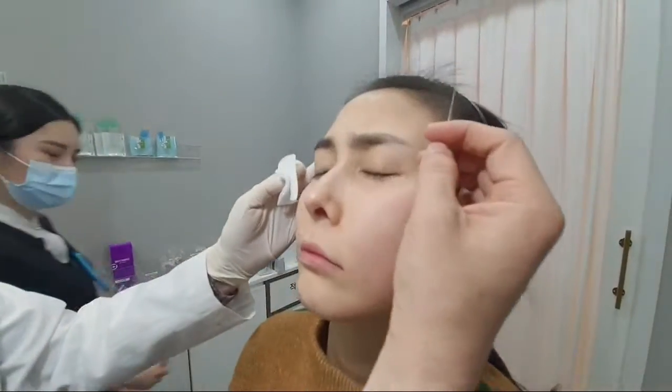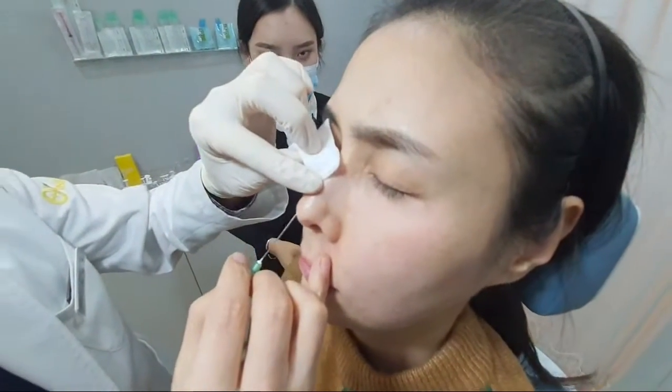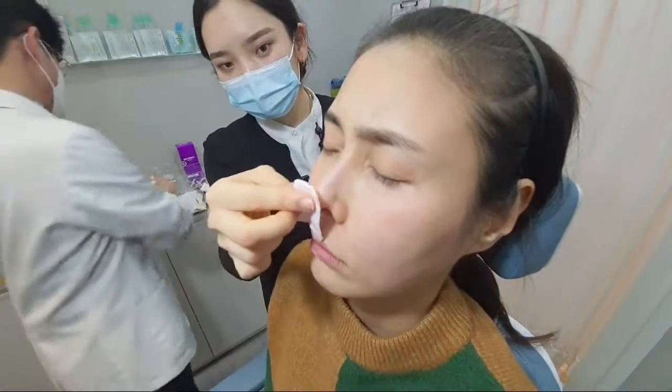Now Dr. Ro is preparing to improve the crooked nose area before the actual injection, just using the punching needle at the point of injection.